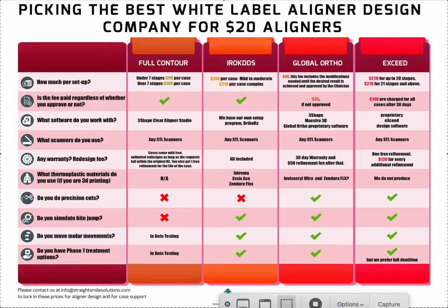Anyways, fast forward to 1997, Align Technology tweaked the prescription and the process of making positioners, and they started calling them aligners. Instead of a one-step process with a rubberized material, it moved to a multi-step proprietary process that involved suck-down material that we used for many decades before that to make retainers and bleaching trays and stuff like that.